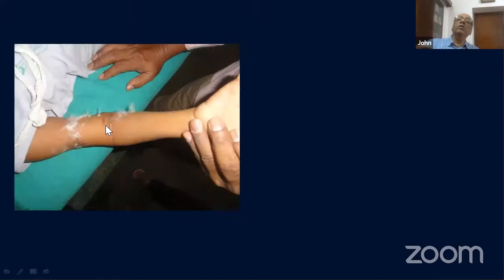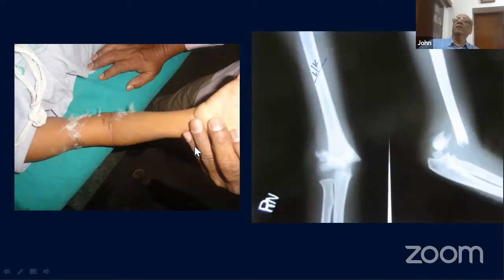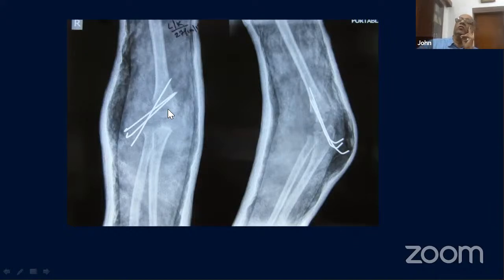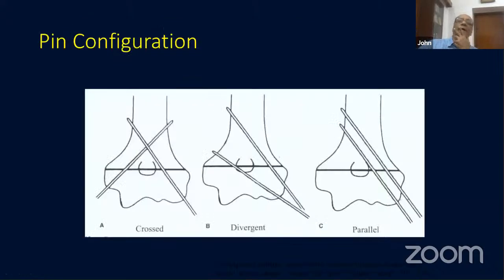The puckering sign occurs when the proximal fragment has gone up through the brachialis, creating a puckering appearance on the skin. This indicates a very displaced fracture requiring the milking maneuver to reduce. In this particular case we used three lateral wires, with one going through the olecranon fossa — what we call a four-cortex wire.